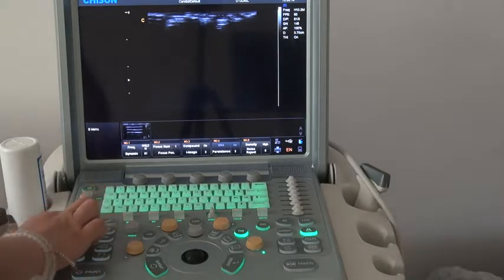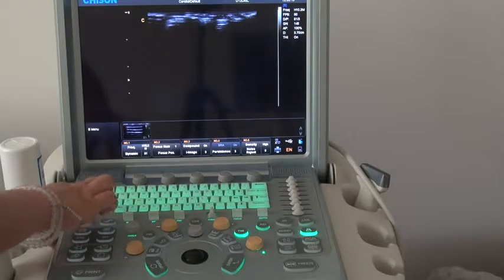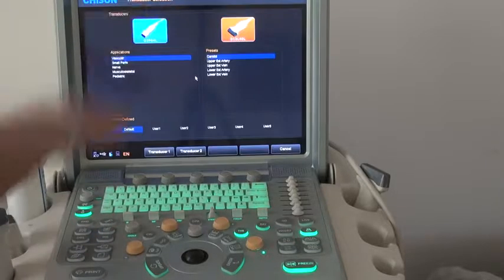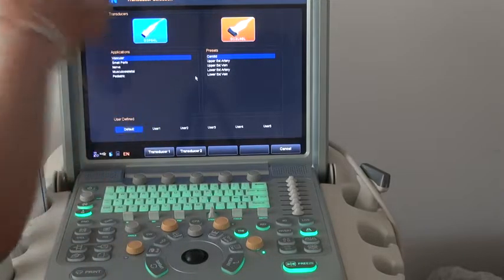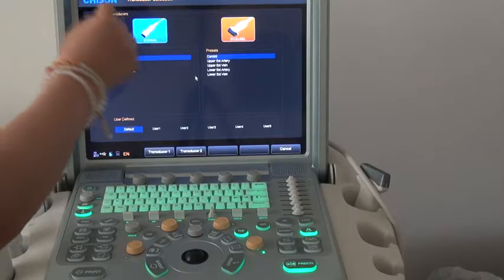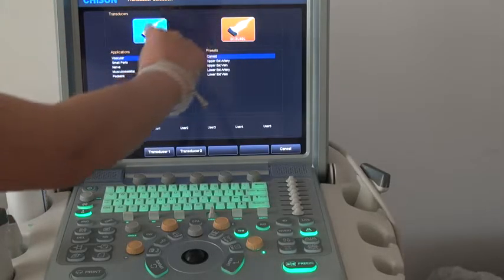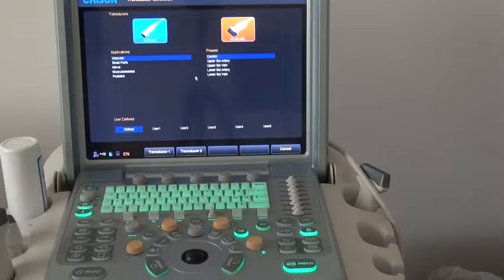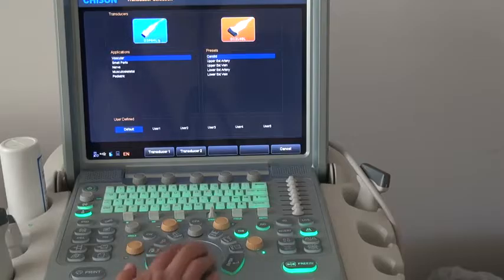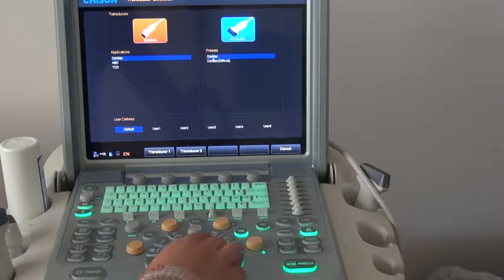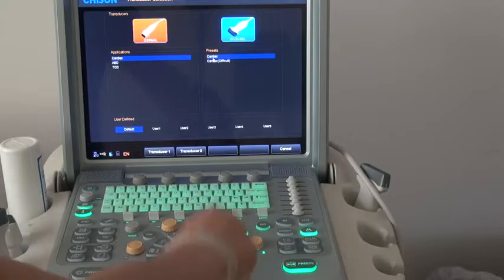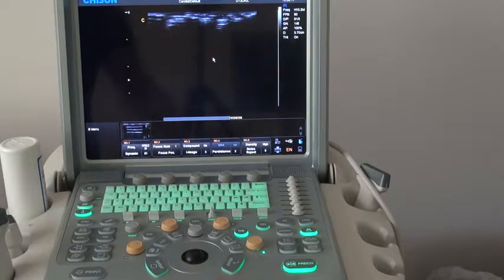Let's get started. Press the probe key to go back to the probe selection screen. You will find that the Q9 can support two probes at the same time. First of all, we choose the phased array cardiac application and click the application twice to go into B mode.